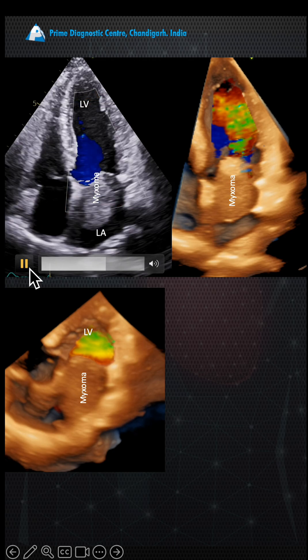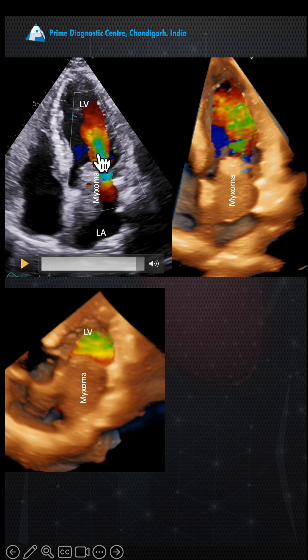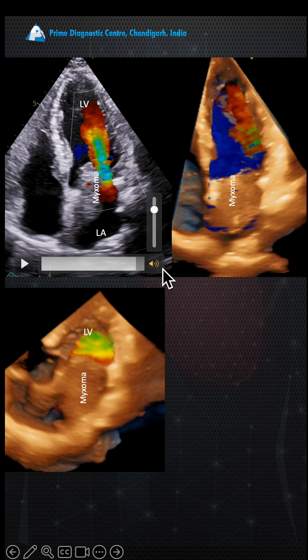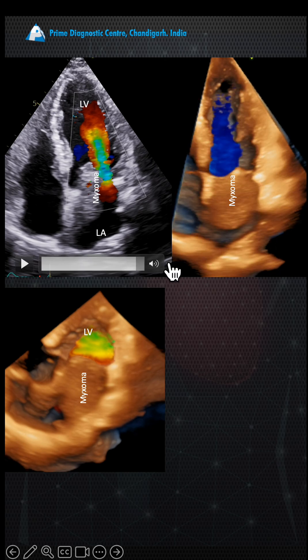This was mildly obstructing the LV inflow, and you can see the LV inflow showing aliasing on the lateral side. This is where the blood was actually coming out, and on 3D also you can see there is aliasing.